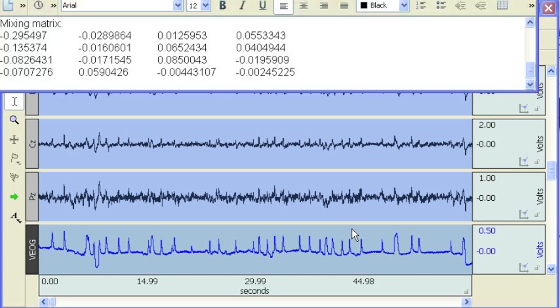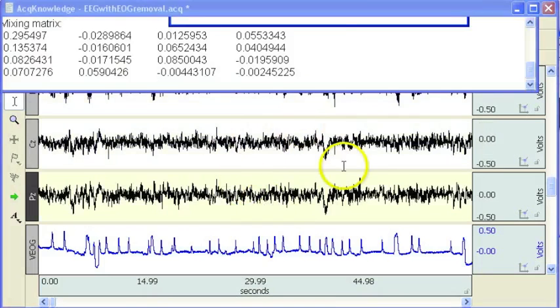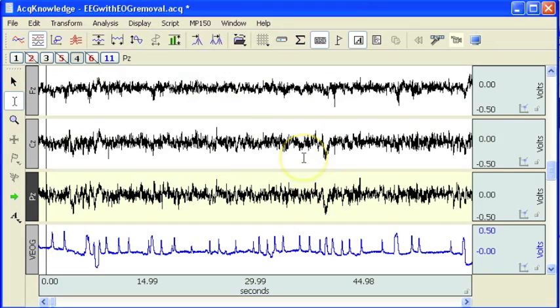The technique that's being used here for removing the eye blinks is independent component analysis, and it tends to work better with more channels of EEG. Three is pretty good, but the more you have the better.